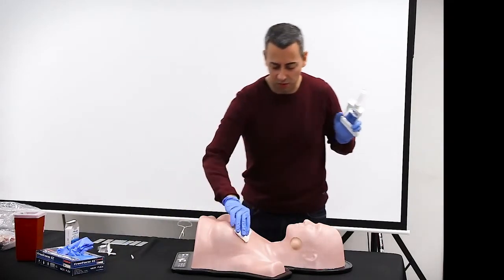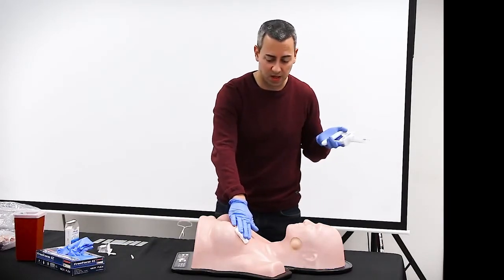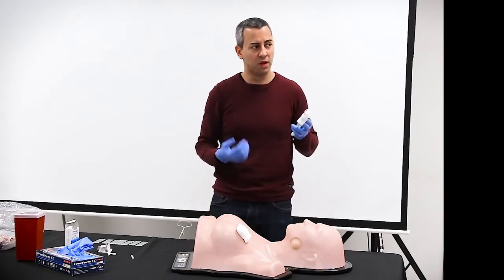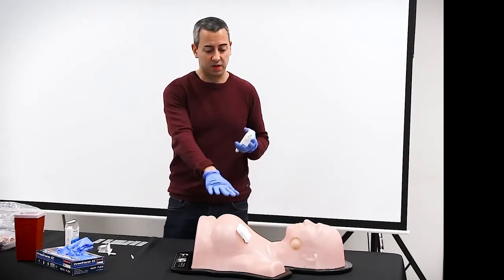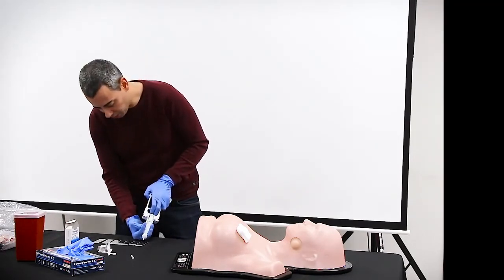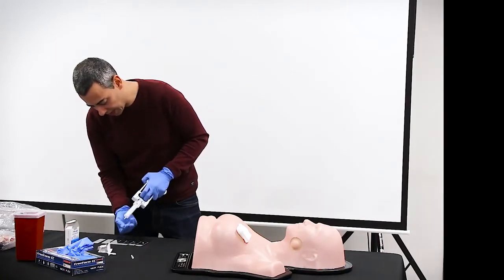Now you use some swab to press to avoid hematomas. You can ask the patient to press a little bit, or if you have an assistant, he can help you. So just a few seconds to obtain a sample, a sample which is going to be expelled onto the slides.